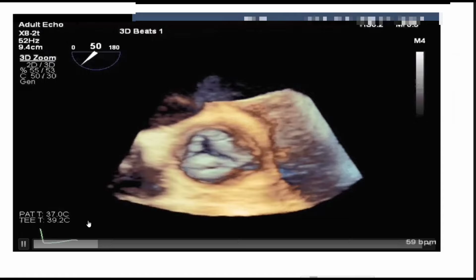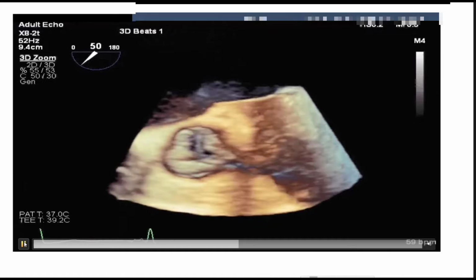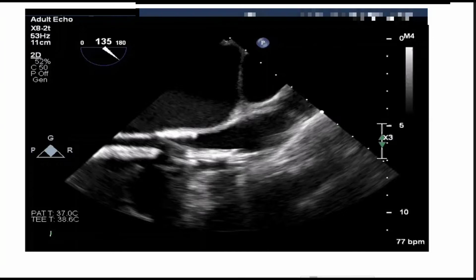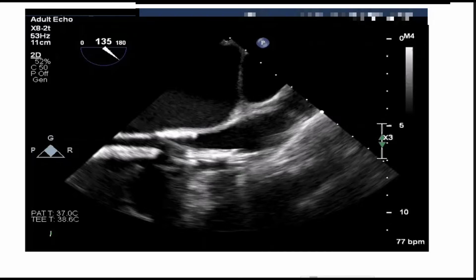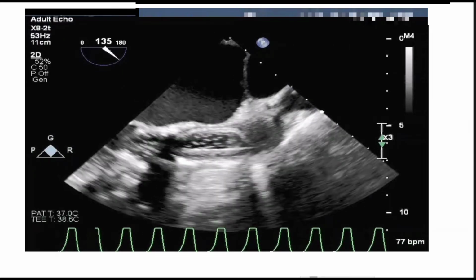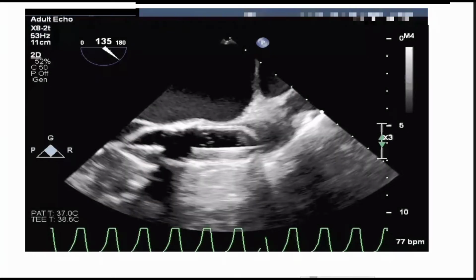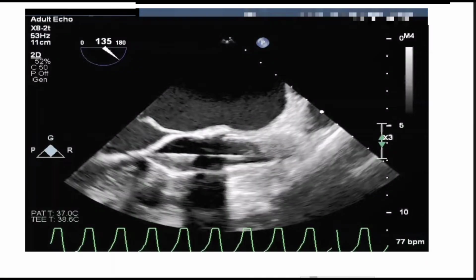When you look at your 3D imaging, that valve is not functioning well at all. And this is what you see in case you guys haven't been in to one of these cases. This will be boring, but this is the balloon going up, and they're pre-dilating the valve that's currently there, the 2013 valve, to make room so that they can put in the TAVR valve. And so that's what you guys see by TEE when you inflate the balloon.